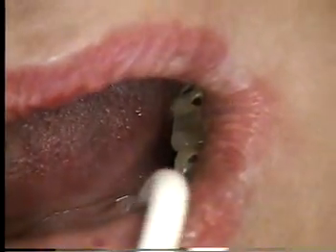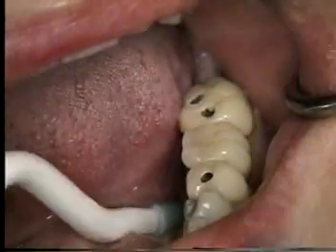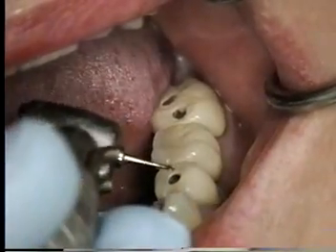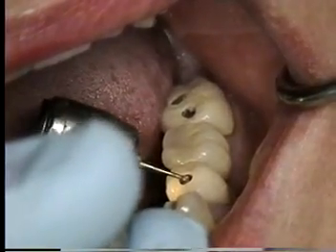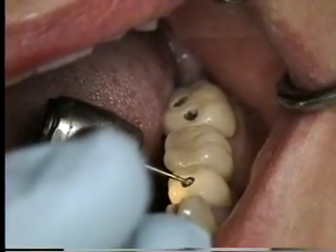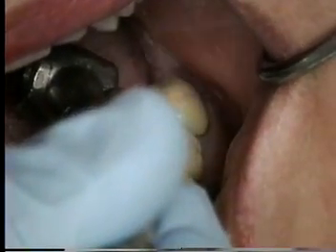The next step is I'll take a number one high-speed burr. I'm going to lay the burr down sideways and turn the water off so I can put a dot right here in the middle of the metal. That way when I go back in vertically I won't be skating around.